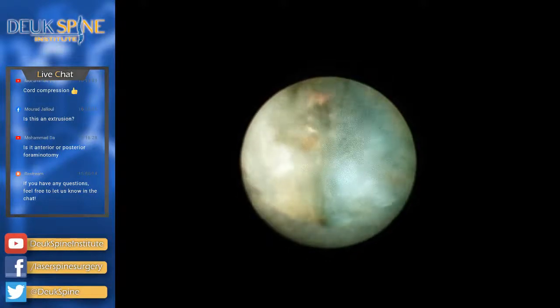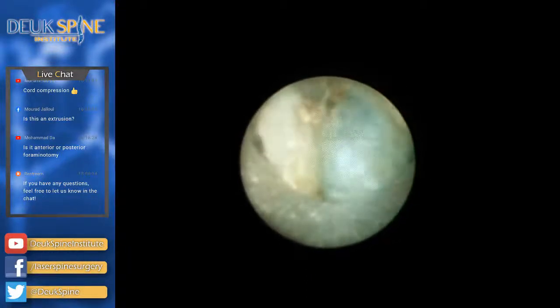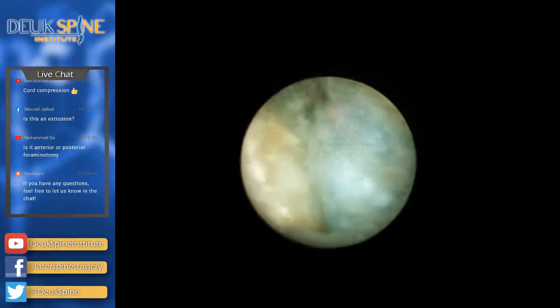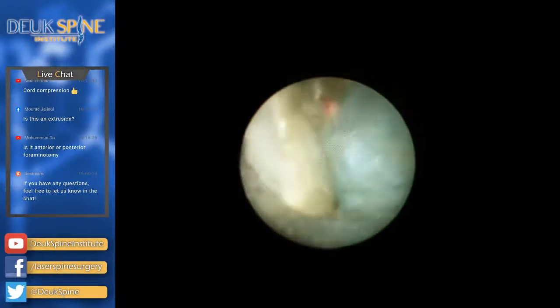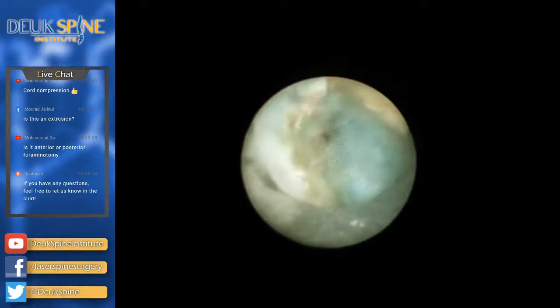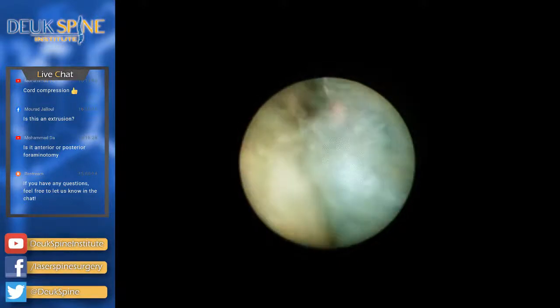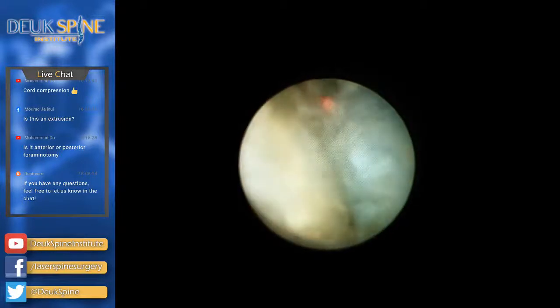It's amazing. We've been taking it out. This is all herniation right where the laser is. All that stuff there. So to me, this herniation is what we call obviously extradural. It's above the dura, but it's also superficial, closer to the disc relative to the posterior ligament. Okay, which is those fibers you're seeing, those thick white fibers. Those are posterior longitudinal ligament.